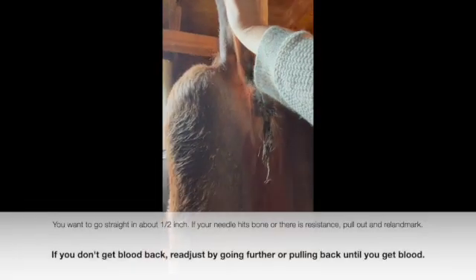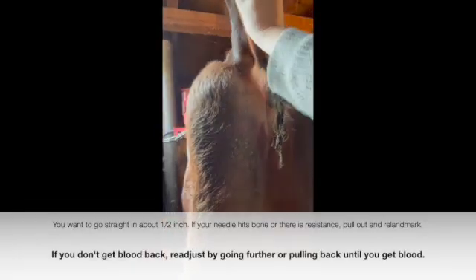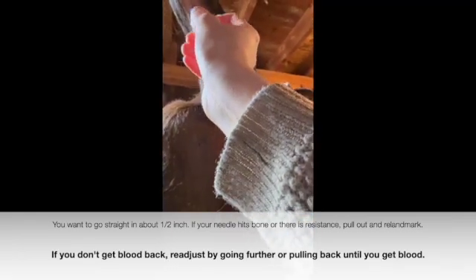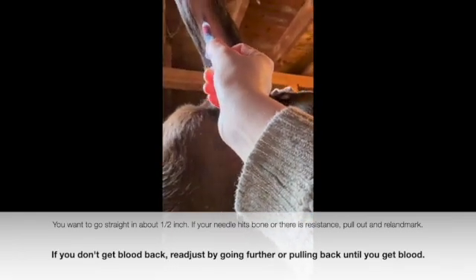They don't like this part so be swift. Once you're in, pull back, get your blood, and pull out. Then you can just hold some pressure if you need to, and all done.